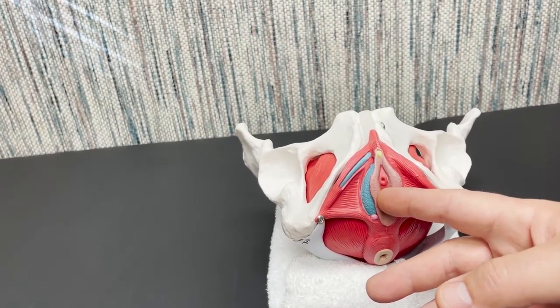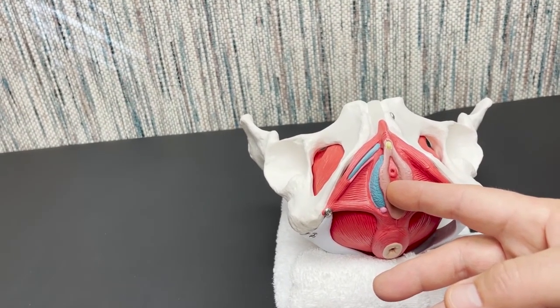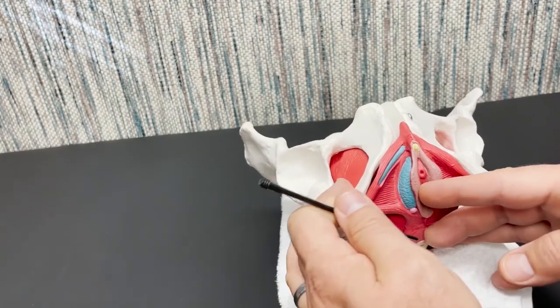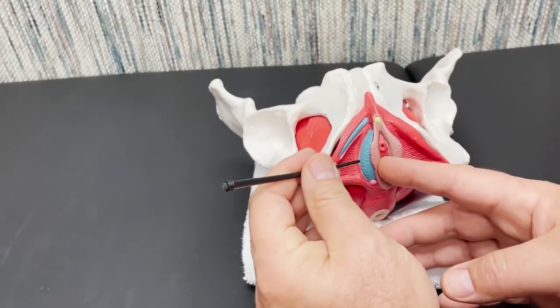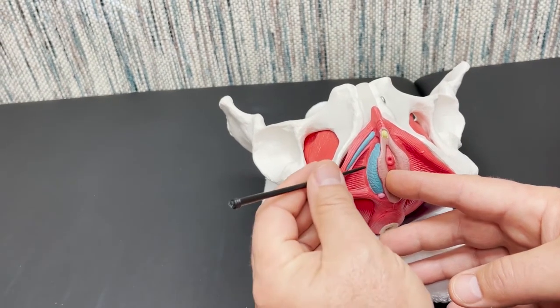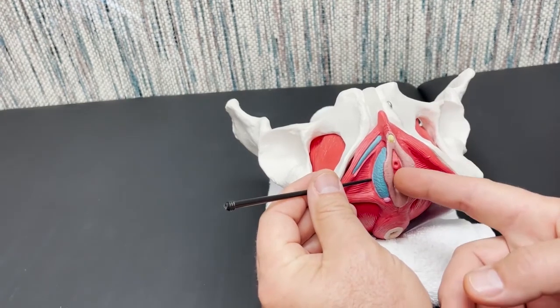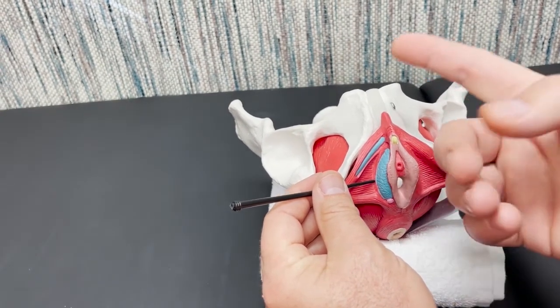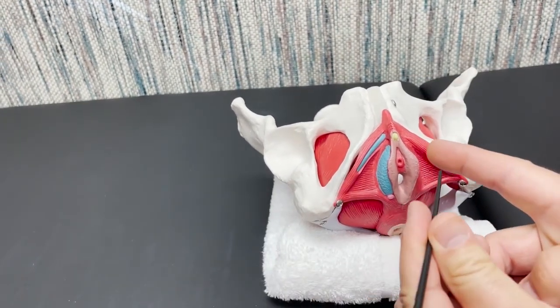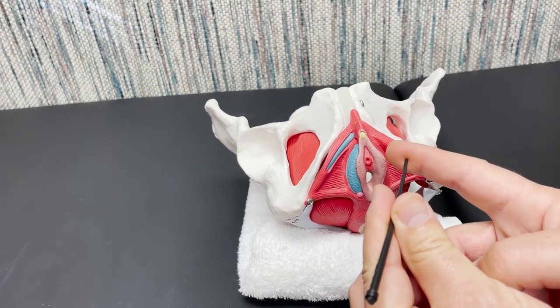We're going to advance the needle from lateral to the labia towards your palpating finger as a backdrop. So here we would avoid the labia and come in right here. Obviously with our finger at a deeper depth to provide that backdrop as we're approximating that bulbospongiosus in the female.